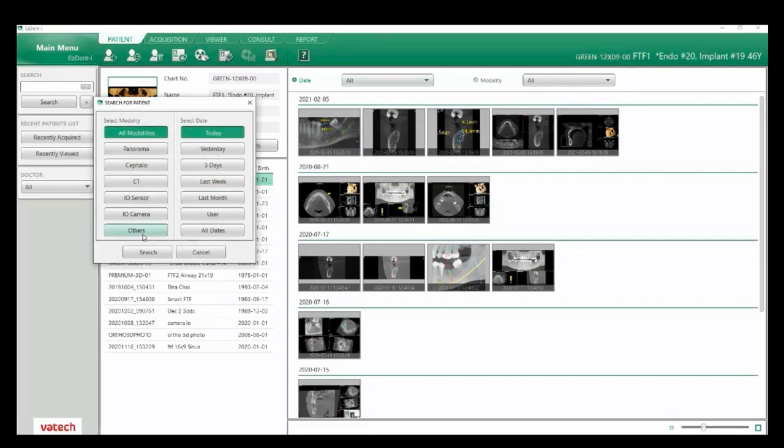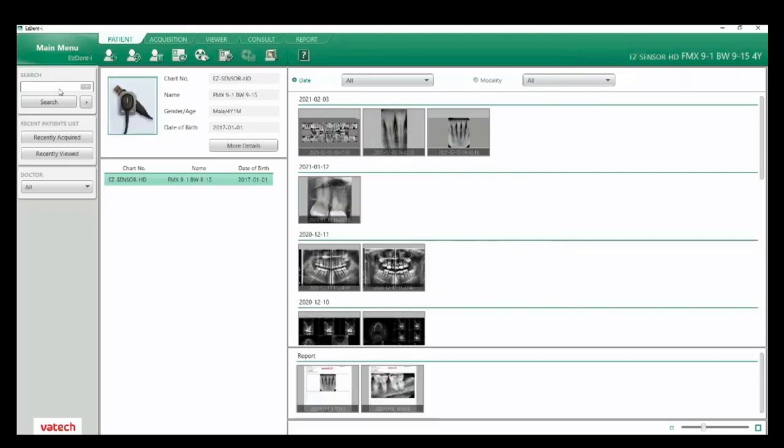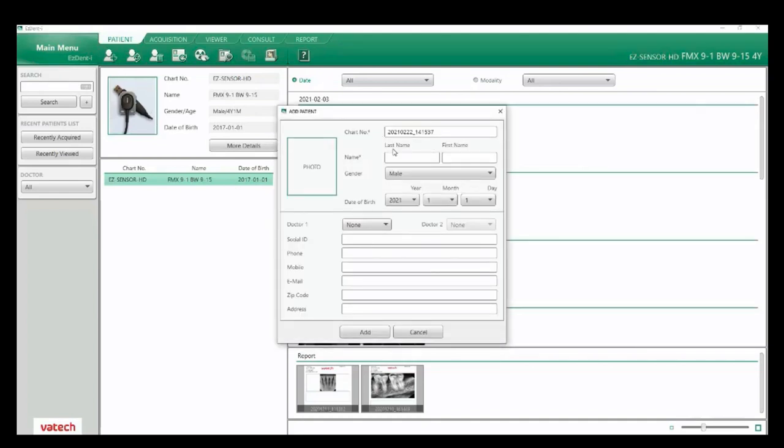Below the search we have our recently acquired patients — you can see the most recent 15 patients, which can be set to show anywhere from no patients up to 30. If your software is set up for multiple doctors, you can choose doctors here. Let's go ahead and click on search and type in FMX, which will bring up my patient with their name, chart number, and birth date. To add a patient, click the plus and type in the last name, first name, gender, and birth date. You can also add a photo by clicking here on photo and selecting open.